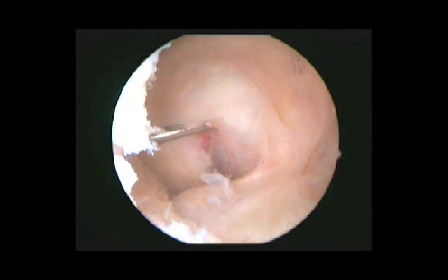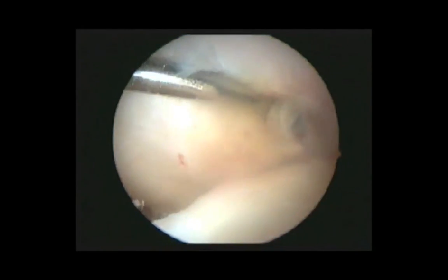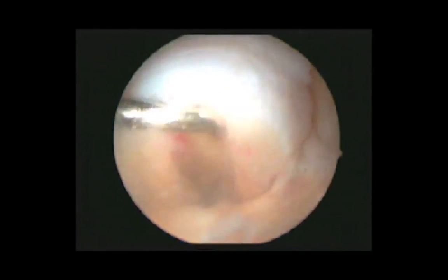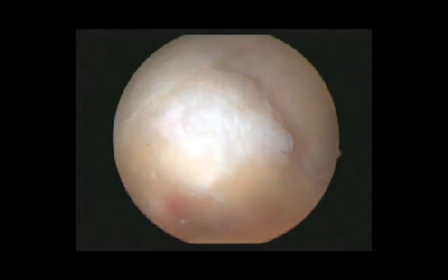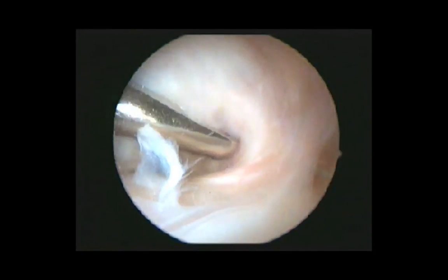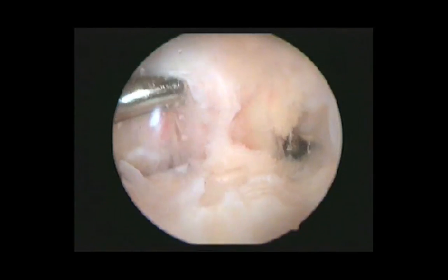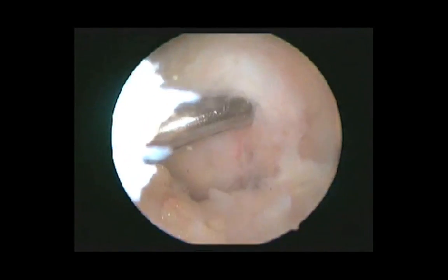Here we are trying to rupture the membrane of the cyst with the arthroscopic probe, so as to decompress the intercondylar notch area. Since we have to make a transeptal approach to the posterior compartment of the knee, gelatinous material has come out of the cyst, which is taken care of by suction using the shaver system.